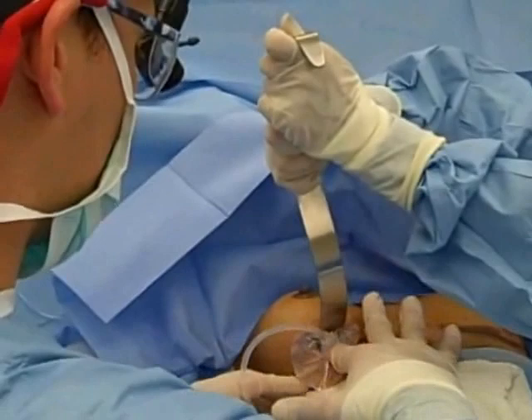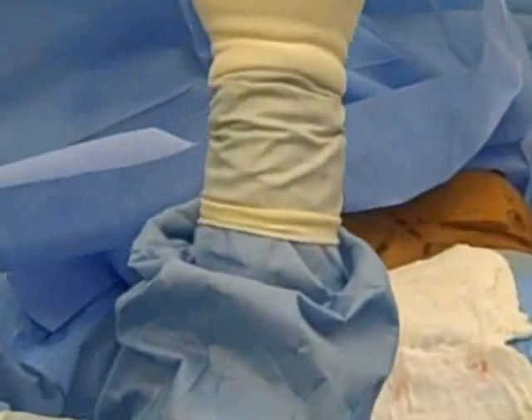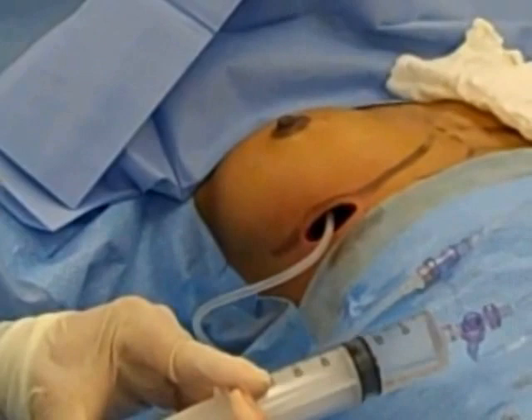We use the fill port to fill them up with the desired amount. We fill the saline implant up to the desired amount, and when we stop at the desired amount, we can alter these a little bit — put a little bit more on one side or a little bit on the other side.